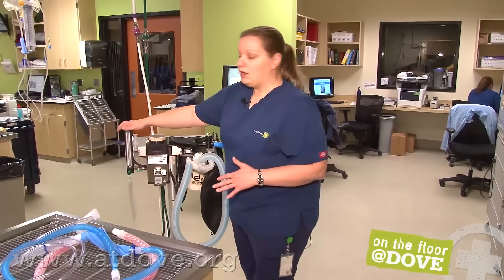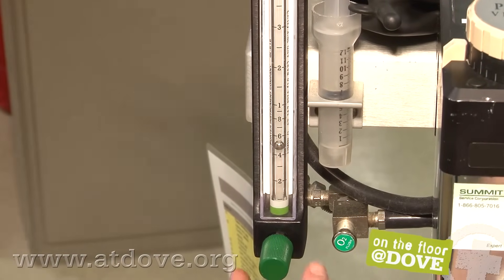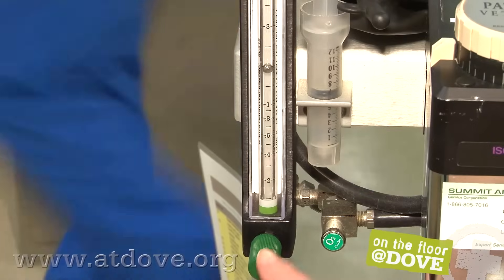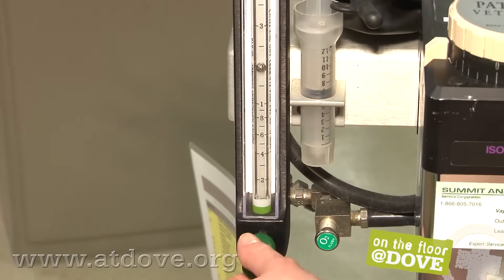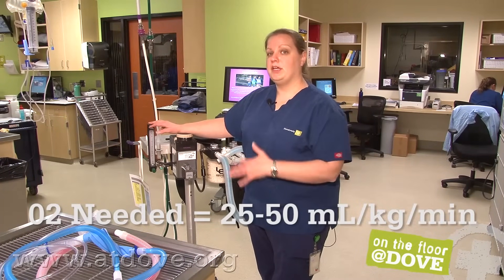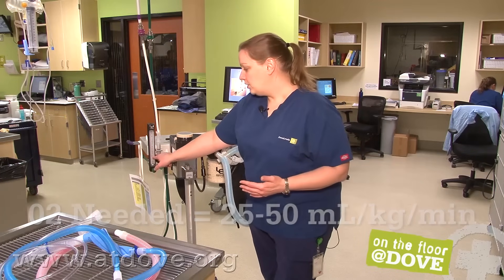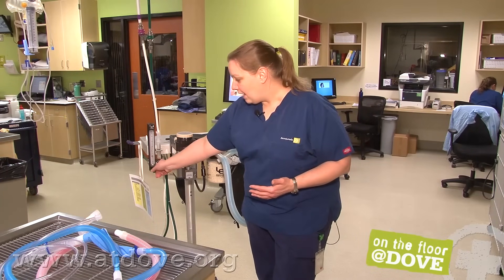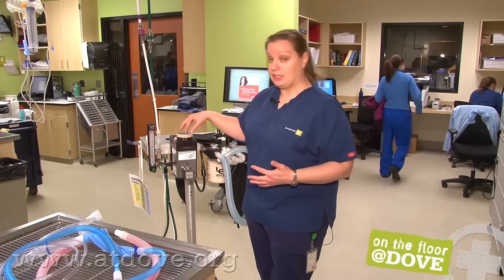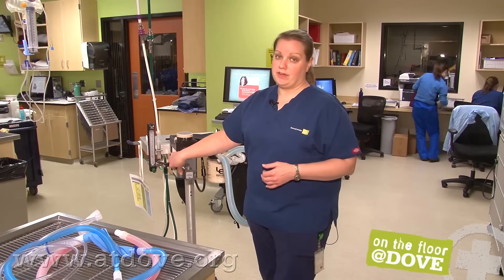I want to move over to the oxygen side of the machine. A lot of people just turn oxygen on to two liters a minute and run their patient under anesthesia at two liters a minute. There is a math equation you can use: the oxygen flow rate your patient needs is 25 to 50 mils per kg per minute. You don't want to go below 500 mils per minute — once your oxygen flow rate drops below half a liter, you'll have problems with the concentration of your gas being exactly what you think it is. So at least 500 mils, but most patients can probably run at less than two liters per minute.